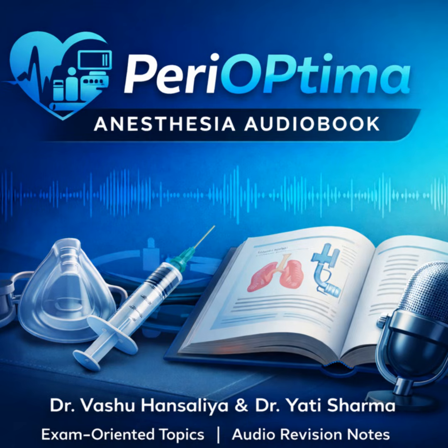You can see the entire glottis, the full length of the vocal cords. Easy. Grade 2 is when you can only see the posterior part of the glottis. You can't see the anterior commissure. And grade 3 is where it gets tough. Very tough. Grade 3 means you can only see the epiglottis. The glottic opening itself is completely hidden from view.